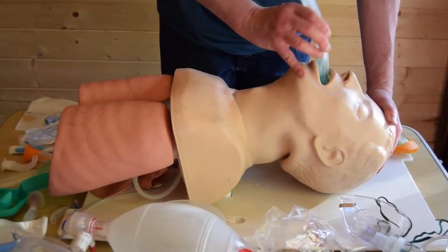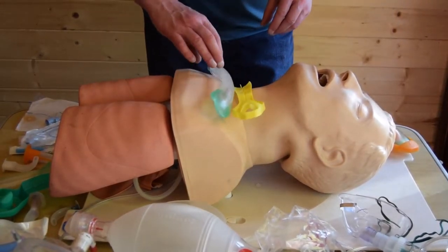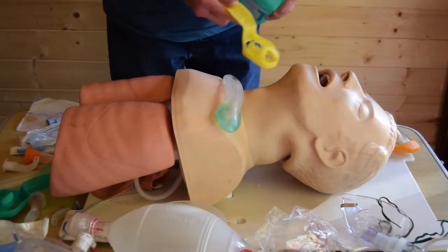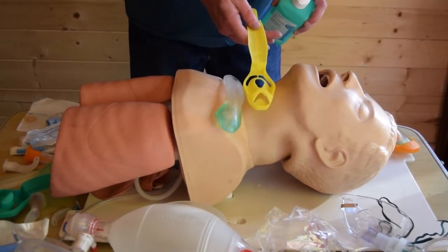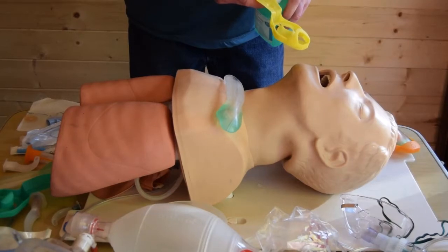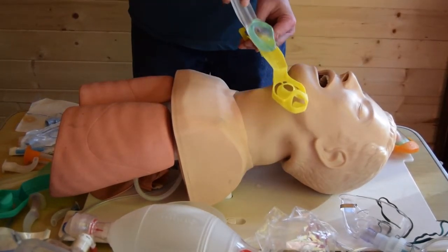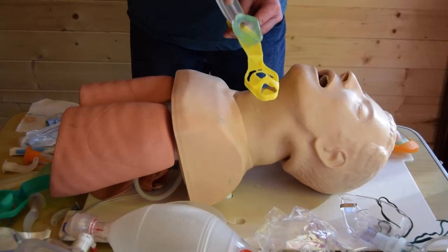It's quite a difficult airway to site, so we're going to use some lubrication to make it slip down more easily. Excuse me while I get some lubrication. You normally use something like a water-based gel, but for this instance we're going to use some alcohol gel, and I'll just sterilise the dummy while we're doing it. So you place the lubricating gel on the cradle, and then you rub the back and the sides of the airway over the gel, and that should slip down nice and easily now.